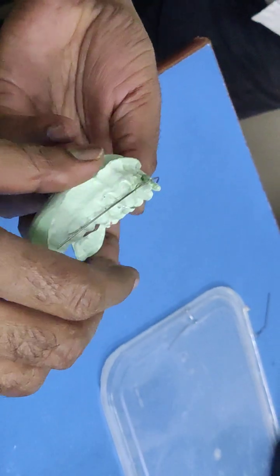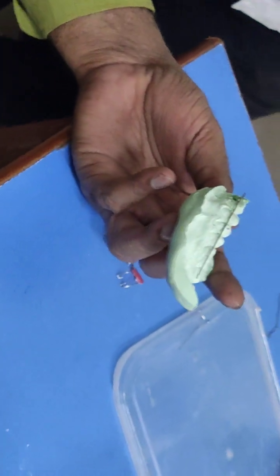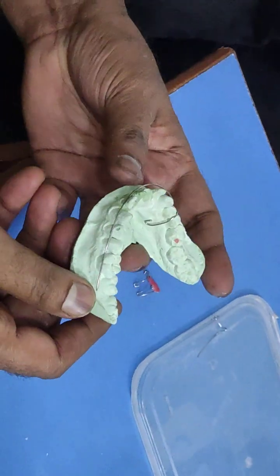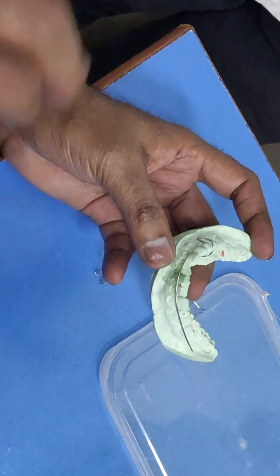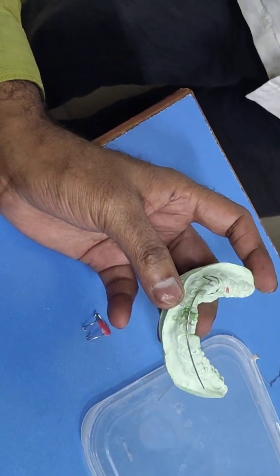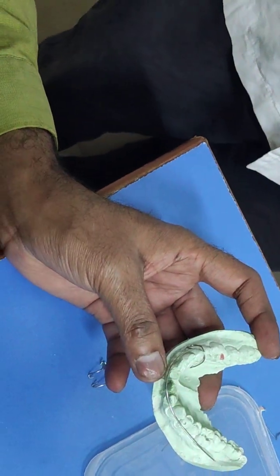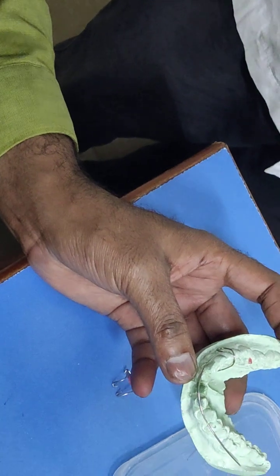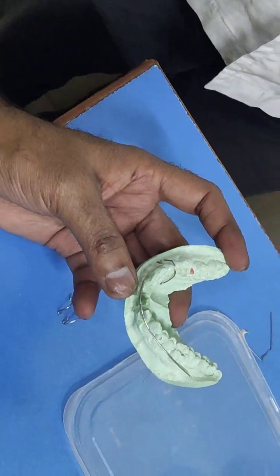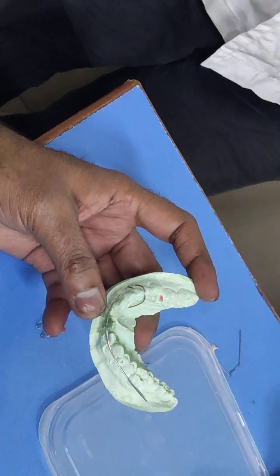Notes, okay. Yes. It is in the same place, okay, no problem. It will touch only the most proclined or most protruded tooth. Yes, normally remember it will touch only the most protruded tooth. Sometimes the patient complains that it is not touching my other tooth. Okay, obvious, no problem. First it will retract the most protruded tooth, then only it will touch the other teeth.